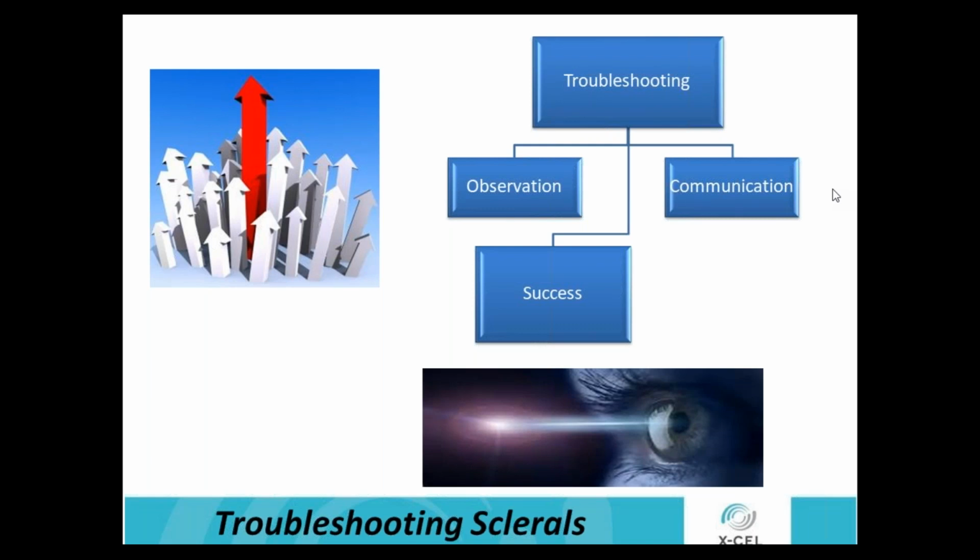And I'll just give you an example. We always start in scleral lenses with, how much central clearance do you have, doctor? And then we can work our way down. So we need to know that first, and then we go down a series of questions. The second question is probably going to be, well, how long has the patient had the lens on? Because that's important to how much clearance you have. And then from there is, how are you measuring that clearance? Is it through a slit lamp? Is it through an OCT?